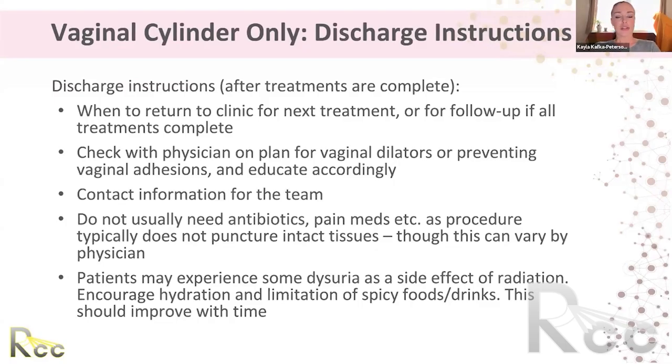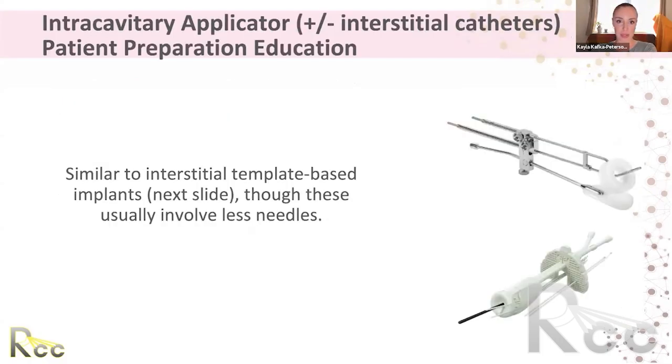Usually for vaginal cylinder only, we don't require antibiotics because it doesn't puncture anything, although again, this can vary by physician. And patients may experience some dysuria as a side effect. Encourage hydration and limit spicy food or drinks. This does improve with time.